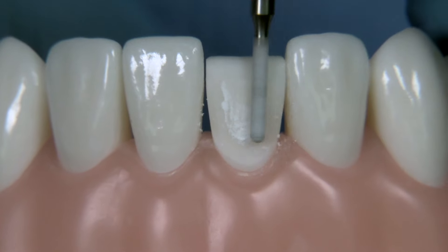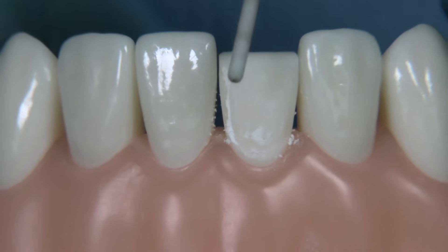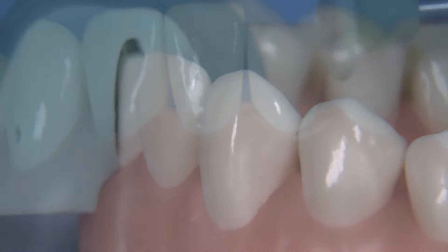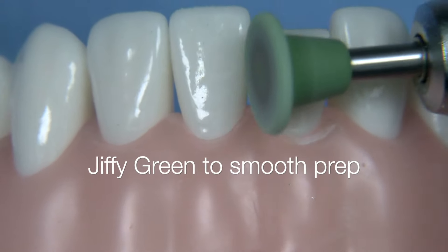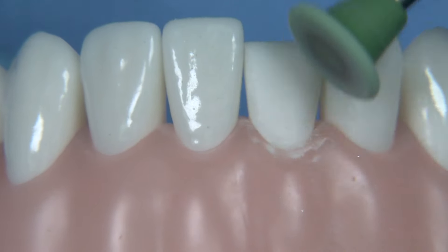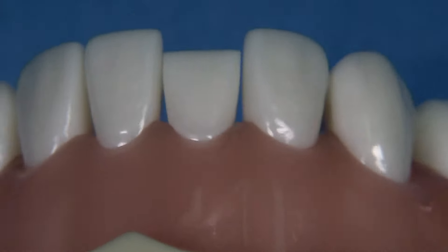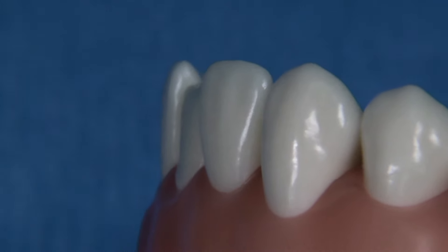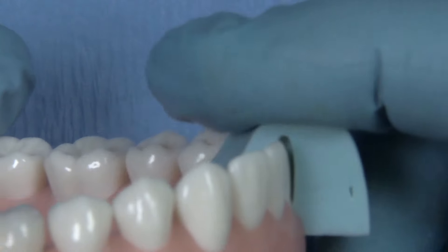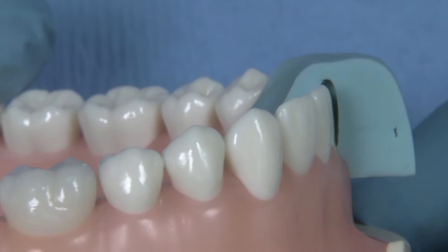Let's utilize the KS0F, which is a 30-micron grit diamond in a slow speed, just to blend all the little areas that may have been slightly irregular. Let's do one last verification with the putty matrix — make sure we're okay. I think it looks good, and then of course we'd like to do smoothing — I'll use discs for this, but also the Jiffy green works really well. I'm using a wheel shape here; I also like utilizing the cup. When you're finally finished, you should have a very smooth preparation and be ready for the impression. It's an unusual prep to do, being a single veneer, but you'll occasionally do them. Thanks everybody, take care.